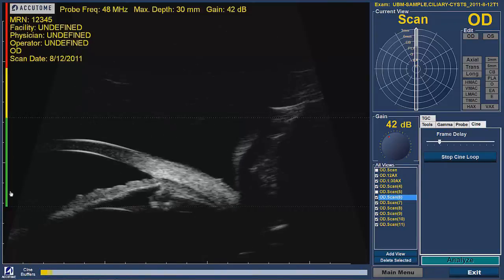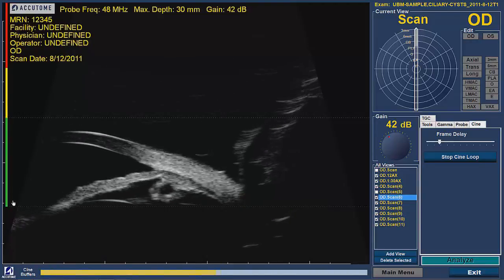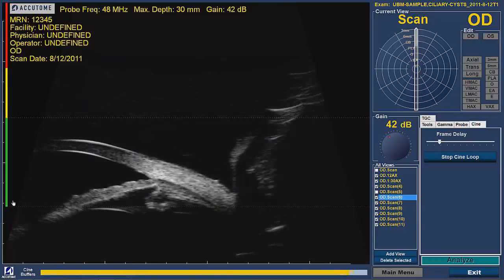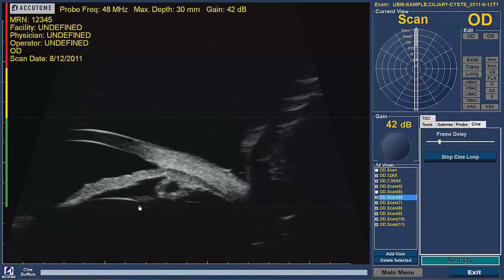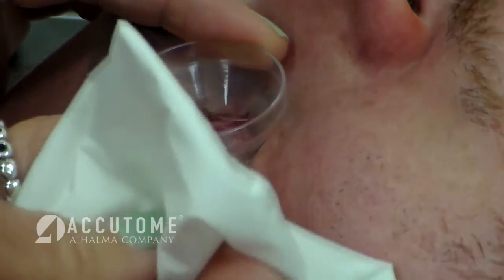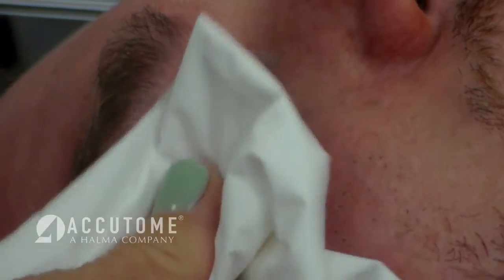The best image quality is in the center of the screen at the same depth as the green indicator on the left side of the screen. The desired anatomy should be imaged in this focal zone. Continue to scan the patient's eye using the selected scanning technique. Remember to start and stop the UBM Plus for each new scanning position and label the scans accordingly.